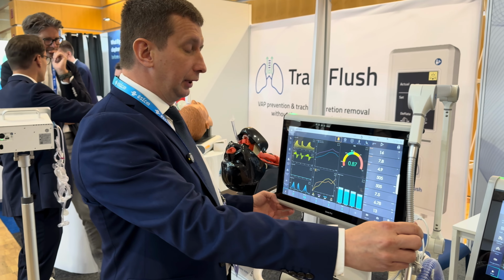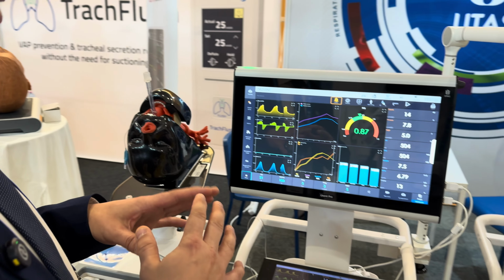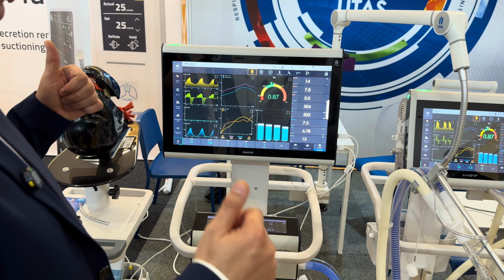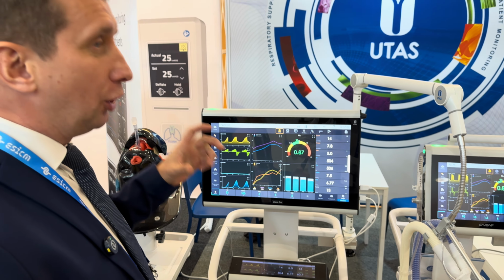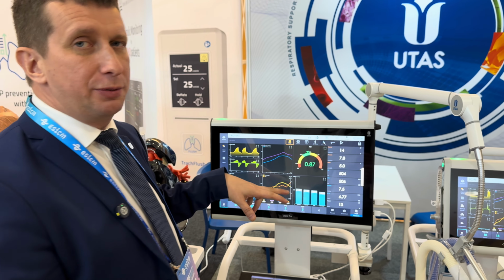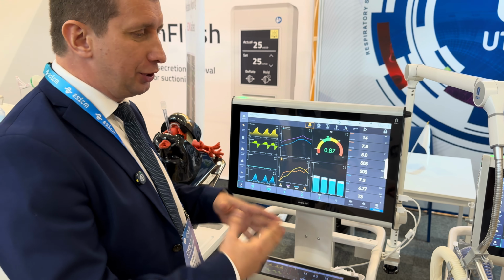The metabolic monitoring is important to have for ICU patients who are staying for a long time in the ICU, so the doctors will have the most accurate technology to measure the energy expenditure by indirect measurement, or indirect calorimetry, so-called.